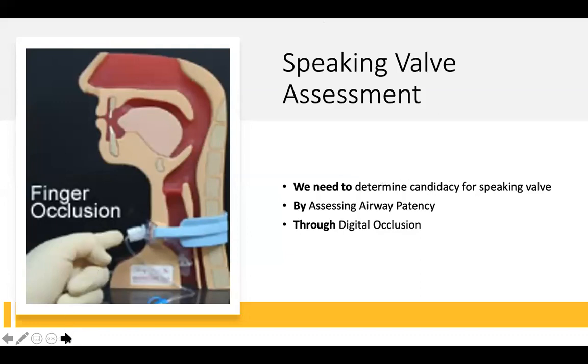Okay, perfect. Okay, so now I'm going to show you a video of a speech therapist fitting a patient with a speaking valve.